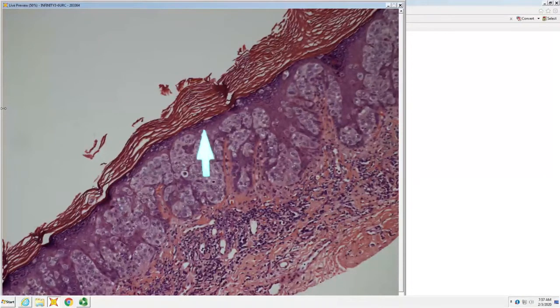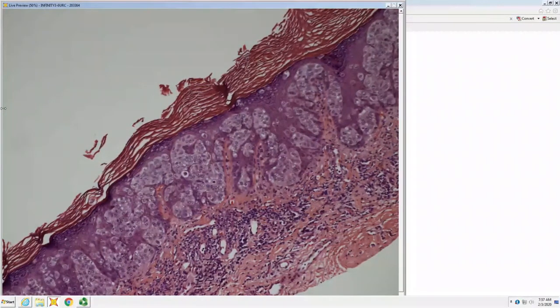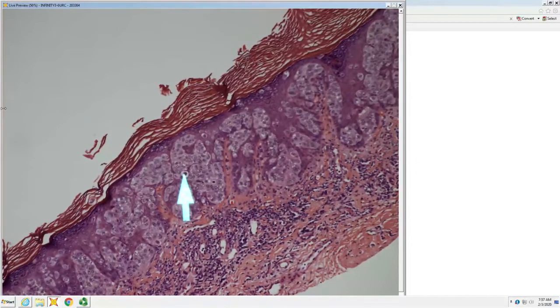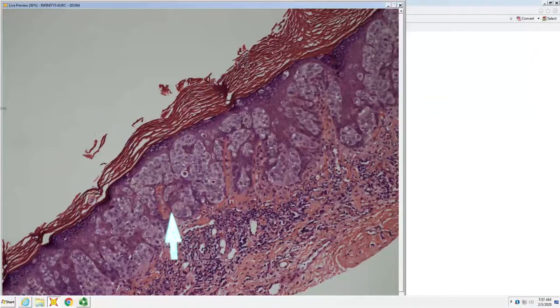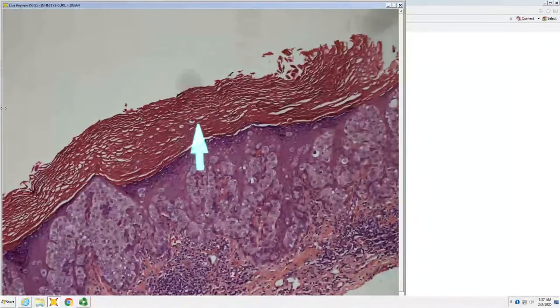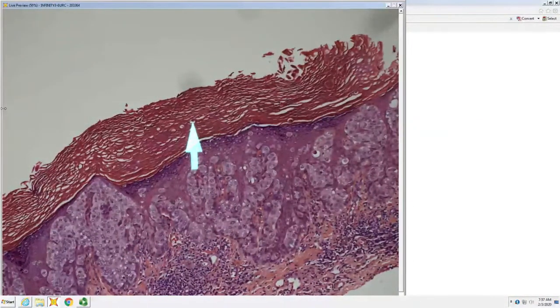So when we see buckshot scatter like that, you sometimes refer to it as Pagetoid scatter. When you see big gray cells with ample cytoplasm in the epidermis, you sometimes refer to them as Pagetoid cells, Pagetoid cytology. And then Paget's versus melanoma, Paget's crushes the basal layer. Bowen's can also. One of the clues there is Paget's tends to spit cells out into the corneum, whereas Bowen's keratinizes, and so it disappears into the corneum.